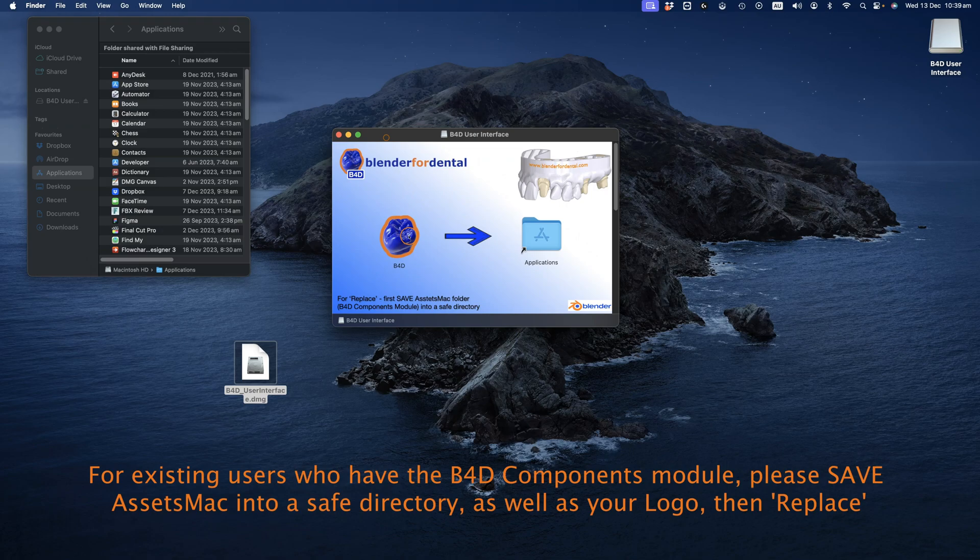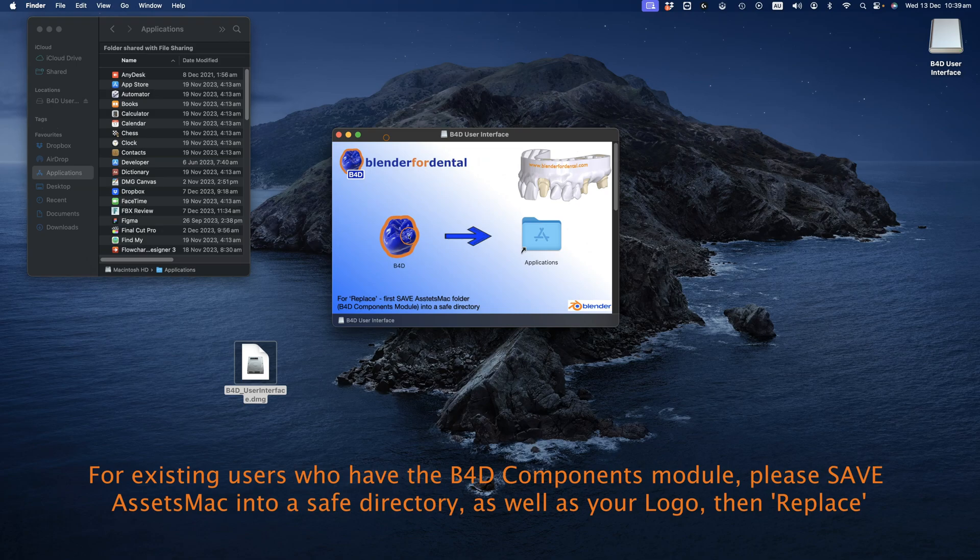If Blender4Dental is already installed, you might receive a prompt to replace the folder. It's important to note that if you have Blender4Dental's Components module, be sure to save your Assets folder in a secure location. The same precaution applies to your logo if you have the Logo Designer module, as these folders will be lost during the user interface's installation.